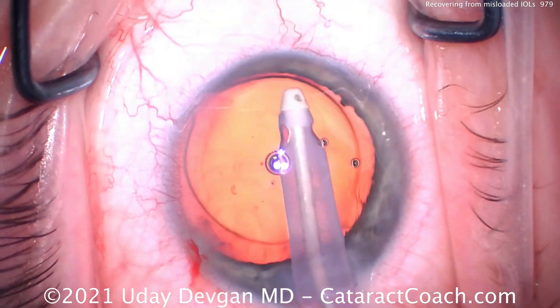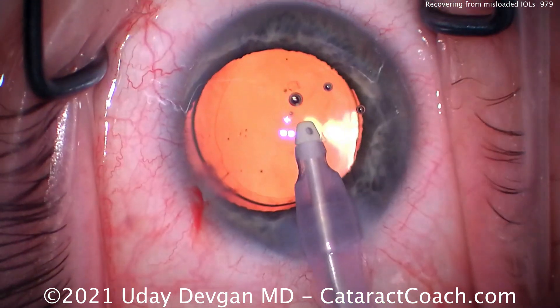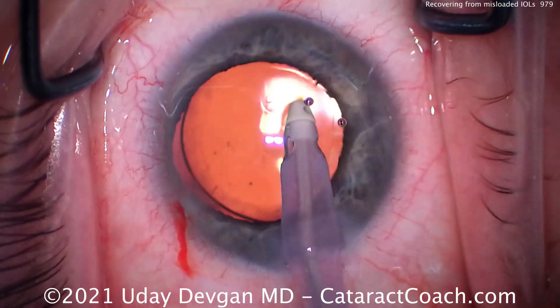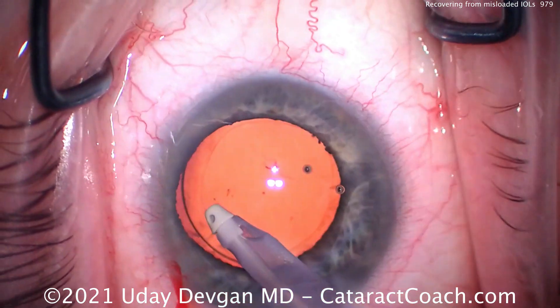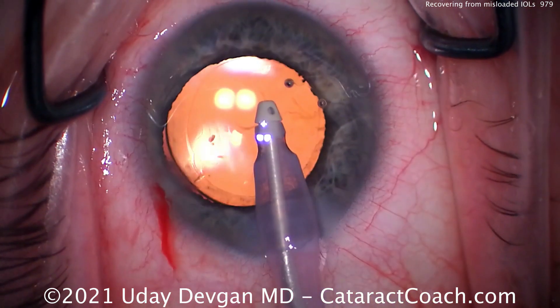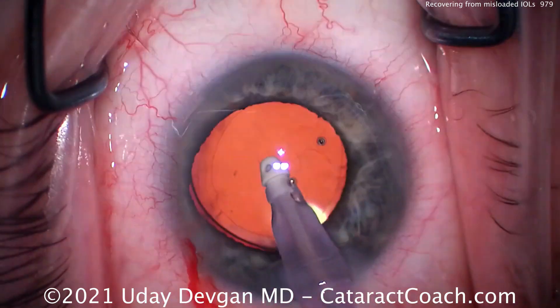The patient will still see fine. But this is really important — we must work with our scrub techs and make sure they're properly trained. It's very important for scrub techs to do this training ahead of time and be supervised. As a surgeon, when that lens comes out of the injector, you have to be prepared for anything. I always look at the haptics as they're coming out, making sure they're in the correct orientation and the lens isn't flipped upside down. Then we just go slowly, little by little.